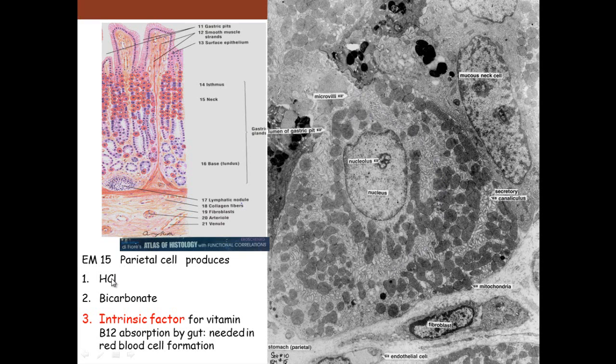So whenever the cell produces hydrochloric acid, really it produces hydrogen ions and then chloride, which get together in the secretory canaliculus to make hydrochloric acid, so it can dump it here and not have to ship it all the way up to the surface of the cell. And so that's a characteristic of parietal cells. It's a big cell and has the lumen go down within the cell itself.